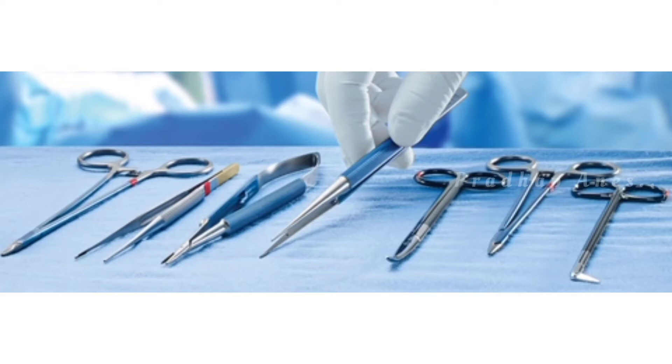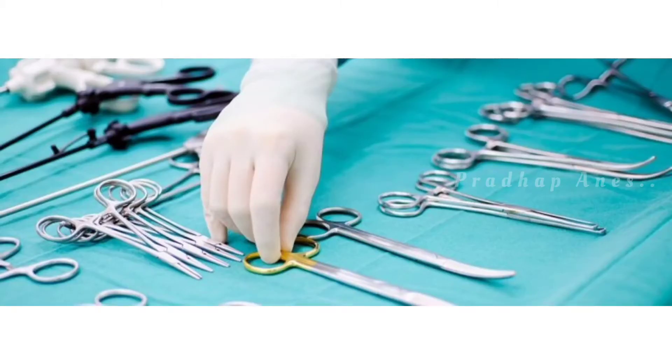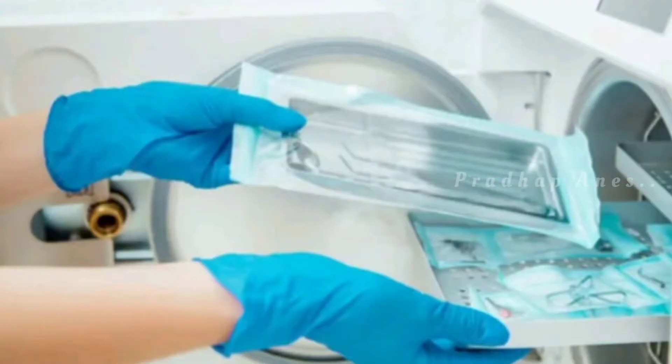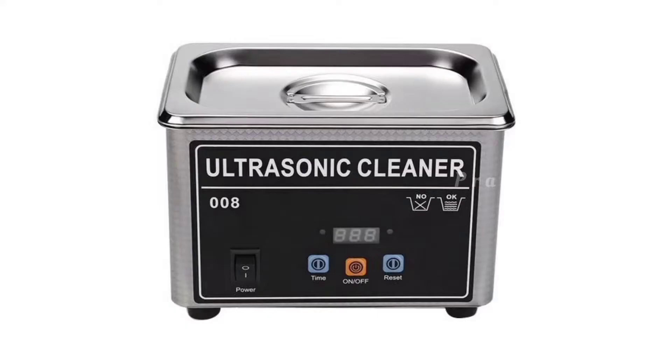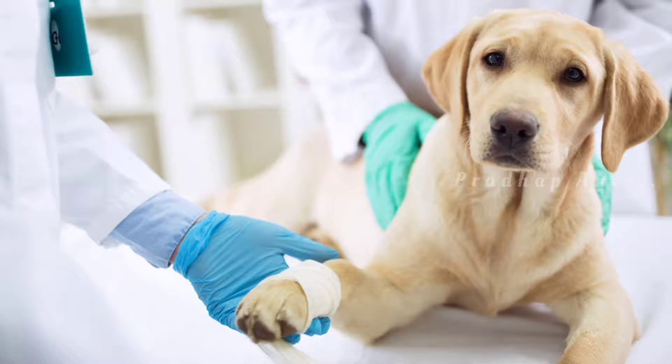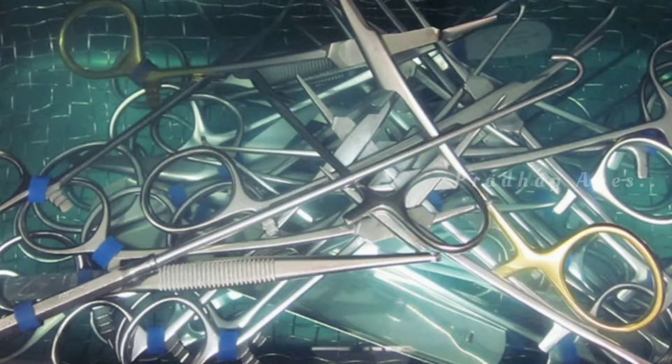Medical and surgical instruments in a variety of sizes can pose challenges when it comes to cleaning, disinfecting, and sterilizing them after use. But this ultrasonic cleaner machine makes the cleaning job easier. Ultrasonic cleaners are great for dental, veterinary, surgical, and medical instrument cleaning.